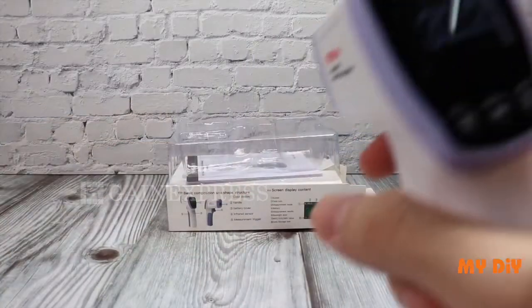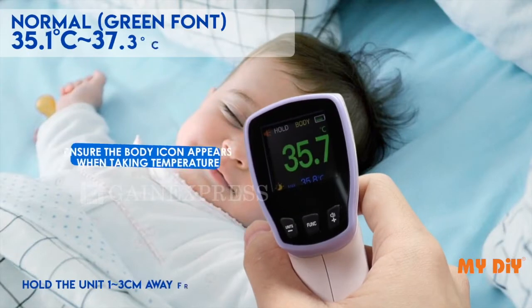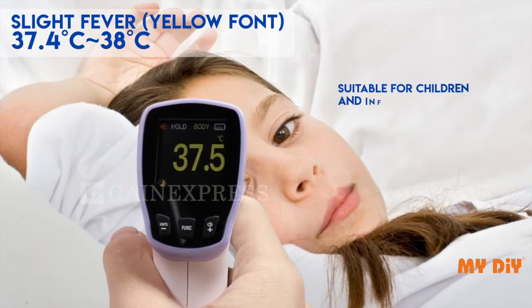If the temperature is below 35 degrees Celsius, the measuring font is white and means you are in standby mode. From 35.1 to 37.3 degrees Celsius, green font indicates normal temperature. This thermometer is suitable for children and infants.